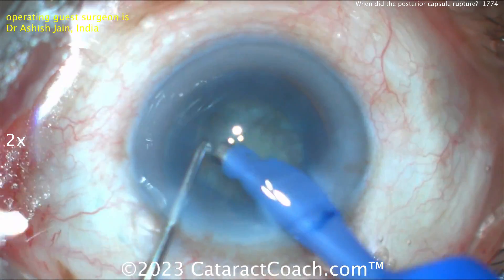Don't come out of the eye — coming out just lets the vitreous come forward. I know you want to switch hands, but put viscoelastic in first to avoid more vitreous prolapse. With the posterior capsule open, you can still get a sulcus lens in, opt for optic capture, and you'll have a good result — but minimize the amount of vitreous prolapse and traction on the retina. If your machine beeps a lot — ding ding ding — that's typically the sign of occlusion with vitreous. And see how that opened up more? There's definitely a big tongue of vitreous coming out now, and that's why that line came out of the central view.